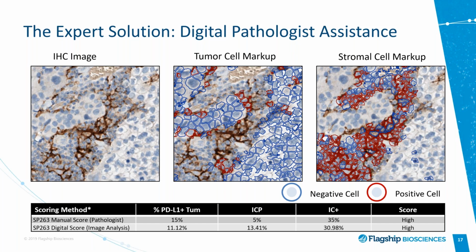In the table you can see an example result of such an exercise, and you can see that generally the results are fairly similar to what is done manually. And one thing I want to say to start this topic is that at every step in this process, slides are reviewed and approved by board-certified pathologists.